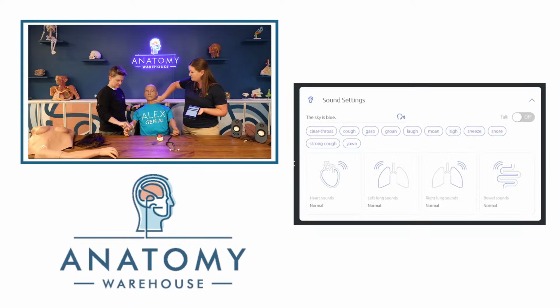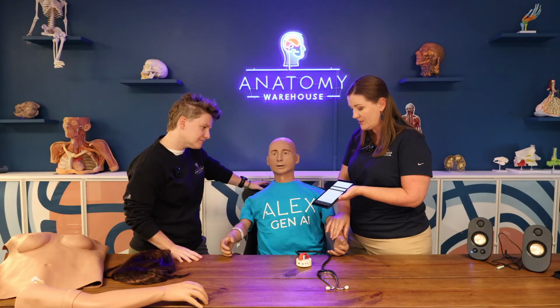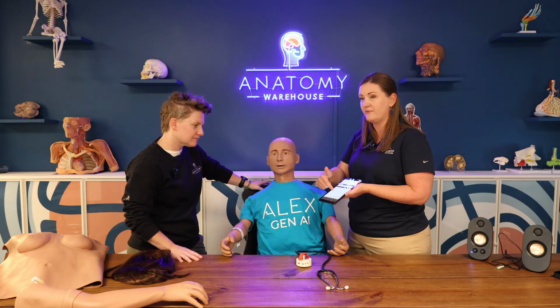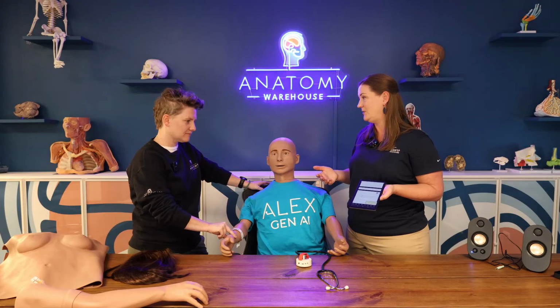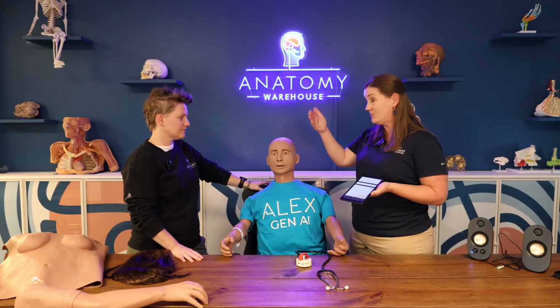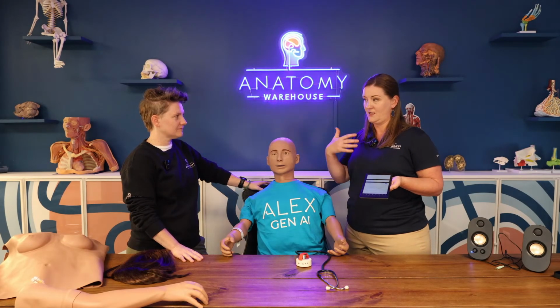There's bilateral carotid, radial, brachial, and also pedal pulses in the feet. As we are palpating and feeling these pulse points, the simulation in the software program is picking up the fact that the left or right radial pulse has been palpated. For instructors, it's really key because they have the opportunity to not only interact and see what's happening from that patient's perspective with the iris camera, but also what the mannequin is feeling.